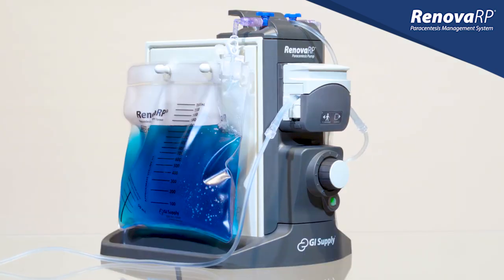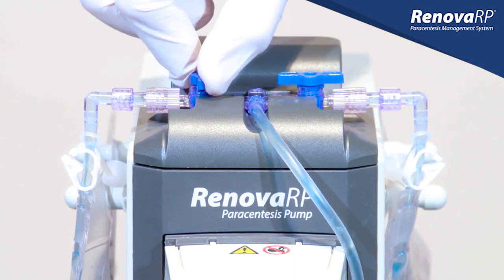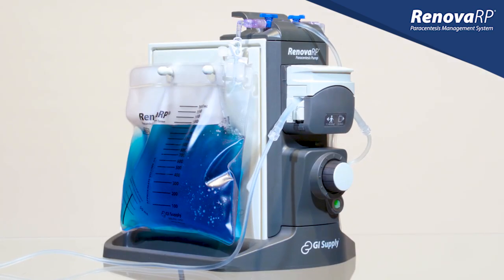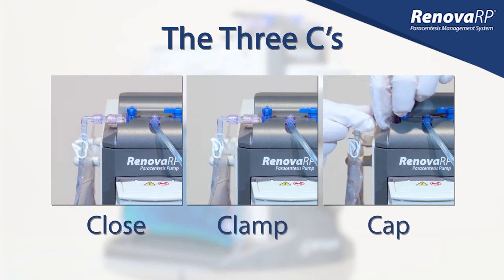Another important point where errors have occurred is when changing the bag. Before clamping the full bag, the stopcock on that side must be closed. If fluid is still flowing to the bag when it's clamped, the pressure of the fluid will put stress on the bag connector and increase the risk of fluid exposure. Use the three C's to help prevent this error: close the stopcock, clamp the bag, then remove and cap.